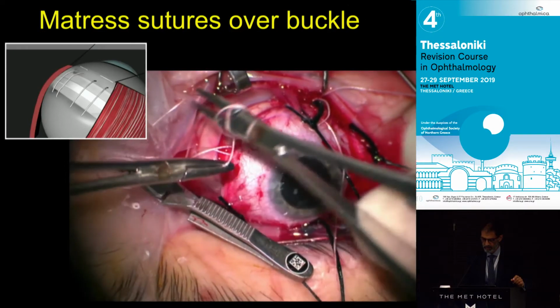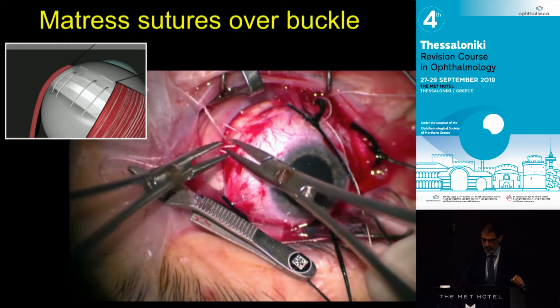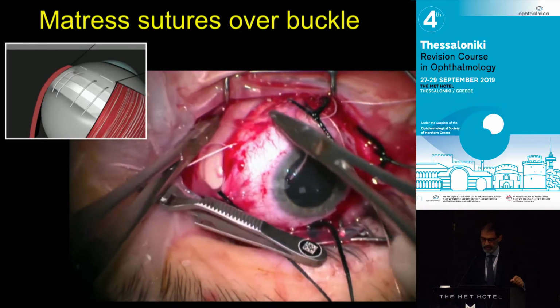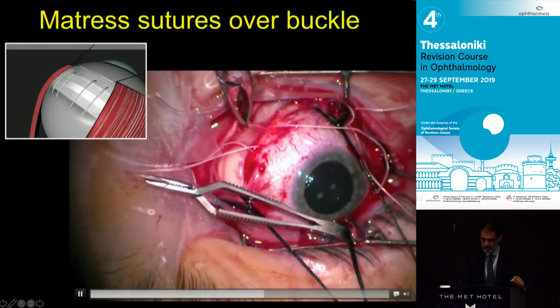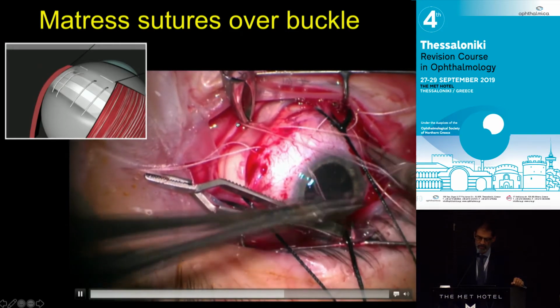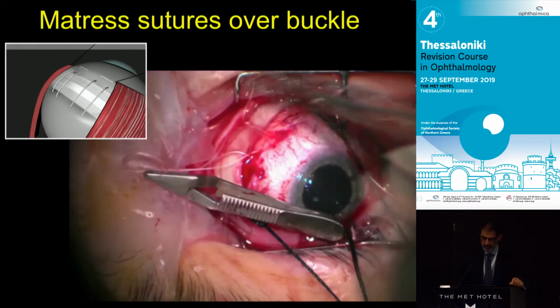I'm only going to do one of these. So here it is here. I need to show you because you always lose that end. So I just wanted to show that in real life. And then what I tend to do is get the assistant to make the indent here. Do not make the indent by pulling the suture. Make the indent physically and then pull the suture to that tension, and then you can close it down like this. So that gives you a nice indent.